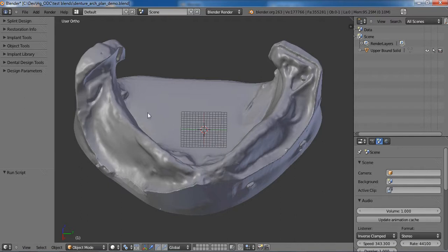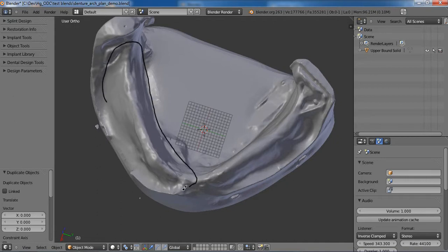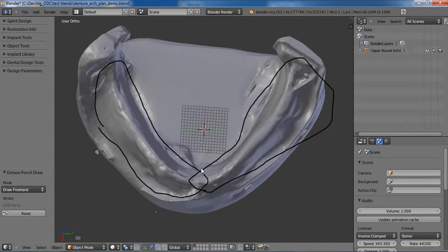So what we did is we held his tongue to one side and took an impression of this area, and an impression of this area. Unfortunately, I didn't get as much overlap in here as we wanted, so this is really just a diagnostic model, and barely at that.